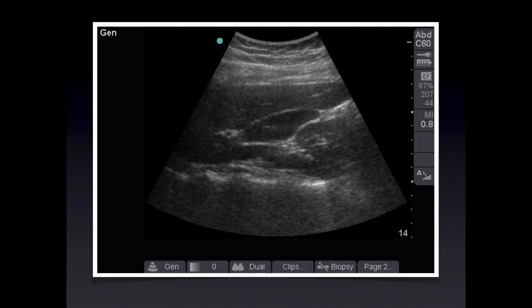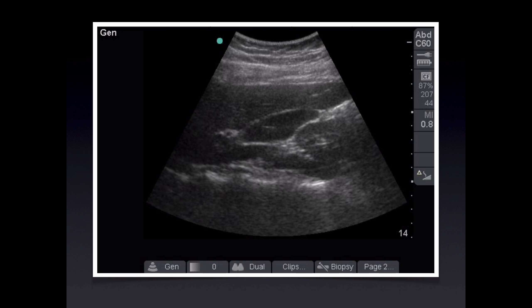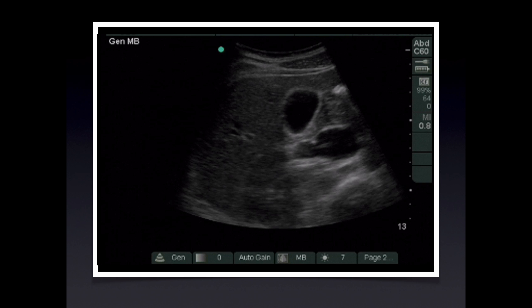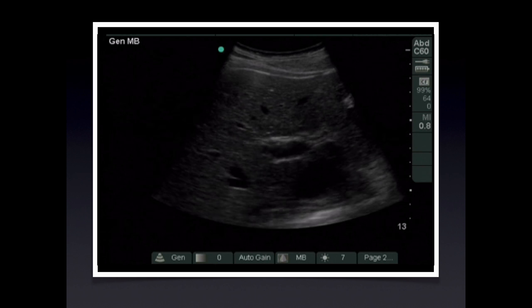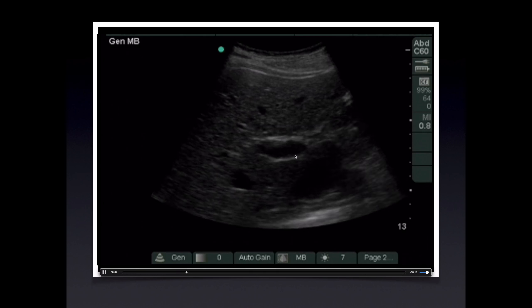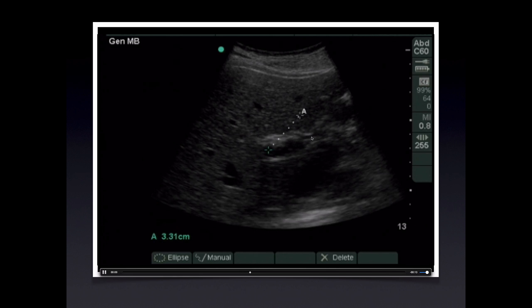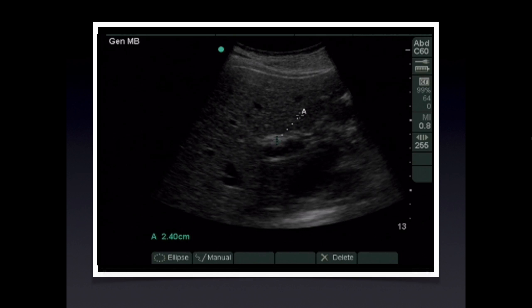We evaluate the patient for the presence of a sonographic Murphy sign by simply pressing down with the transducer immediately above the gallbladder and asking the patient whether this elicits pain. After the gallbladder is evaluated, the common bile duct is identified and measured to finish the right upper quadrant scan. The portal vein serves as the major landmark for its identification. This clip shows a gallbladder fossa sweep in transverse plane, moving more and more superior until the portal vein comes into view, then the image is frozen when the common bile duct is seen just anterior to the portal vein and it is measured inner wall to inner wall.